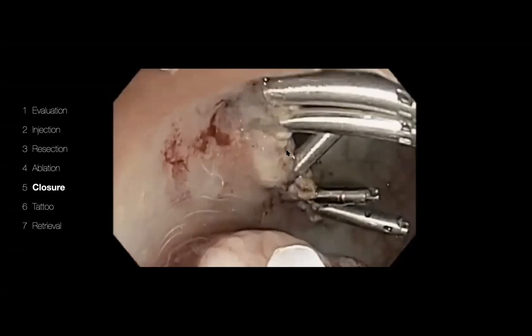Right. So a couple of things that I would like to share with the group. We started with Endocut Q313. When I first started, way back in early 2010, I reached out to Michael Burke and asked him what he would do. That's the setting he was using, and that's what I used for this case.